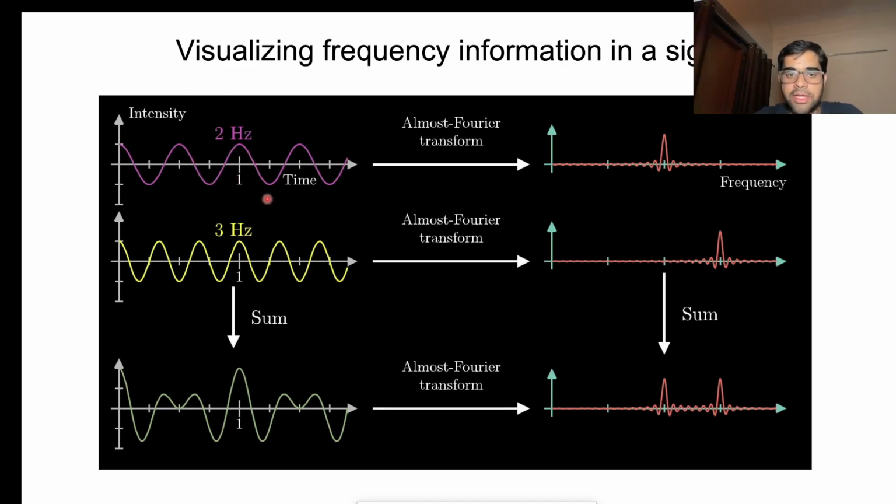And in this kind of a signal, when you do a Fourier transform, it's like a measurement, so it's not exact, it's an estimation. What you get is a small peak like this. When you transform it, this axis becomes the frequency axis. Unlike this, which is the time axis, this is a frequency axis. You see a peak at that particular hertz, and that is the 2 hertz when you do a Fourier transform on this sinusoid.